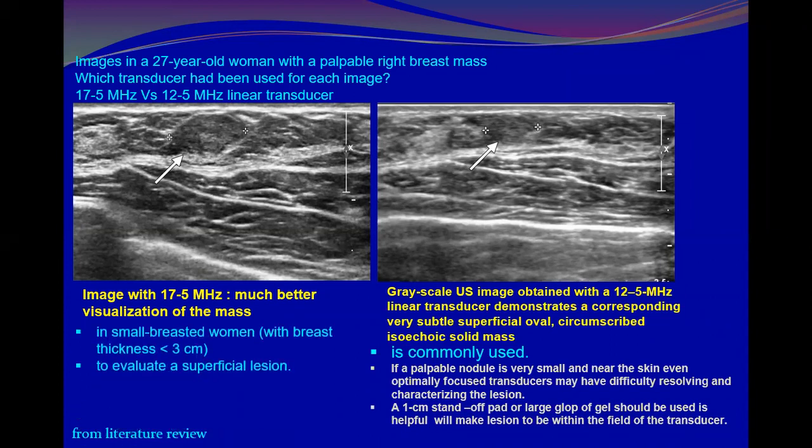And usually, what is the depth of each transducer? Okay, we'll discuss later. No problem.